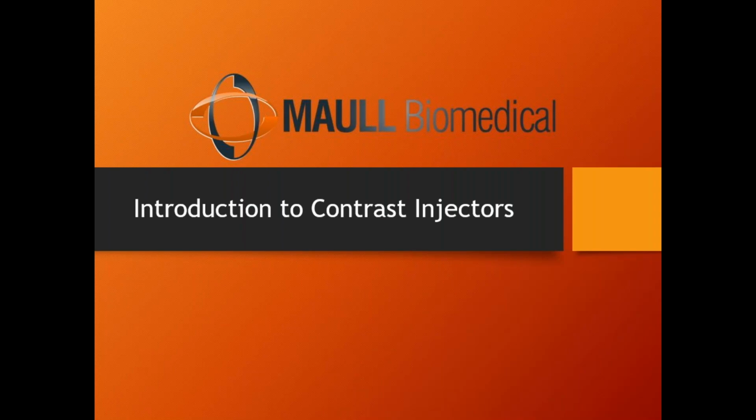Bone, for instance, compared to soft tissue, is thicker and denser. So X-ray photons that strike bone tend to get absorbed by the patient. X-ray photons that don't strike bone pass through the soft tissue of the patient. They tend to penetrate and hit the plate. That's why your typical X-ray image is a dark background, and the white areas of the bone show up because the bone blocked the X-rays from striking that plate, making that part of the image lighter. So that's the basics of how an X-ray image is produced.